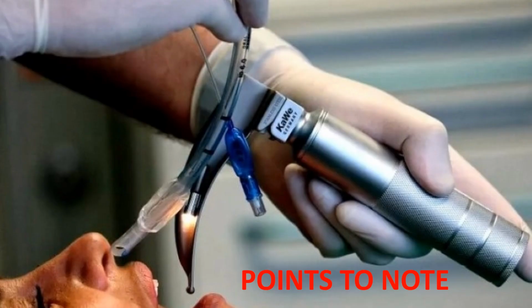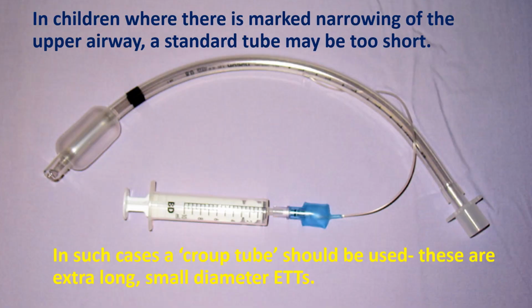Here are some points to note. The first point is for children who have croup. This is because these children have marked narrowing of the upper airway, and a standard tube may be too short. So in such cases, we have a croup tube, which is extra long with small diameter.